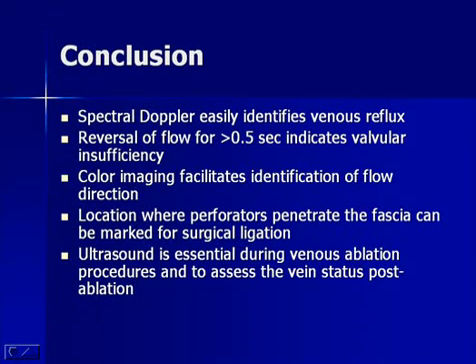And we're not only going to use ultrasound to diagnose venous insufficiency, but we're also going to use ultrasound during treatment procedures such as vein ablation, and also to assess status post-procedure.